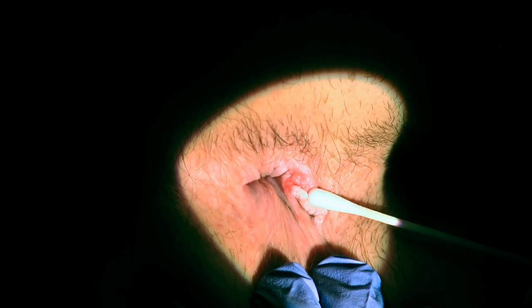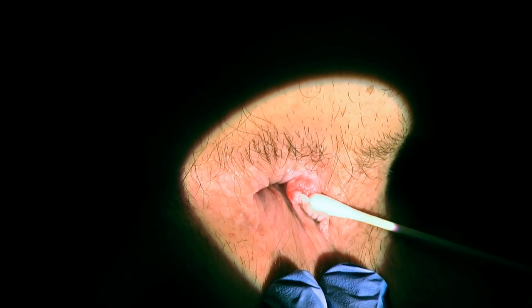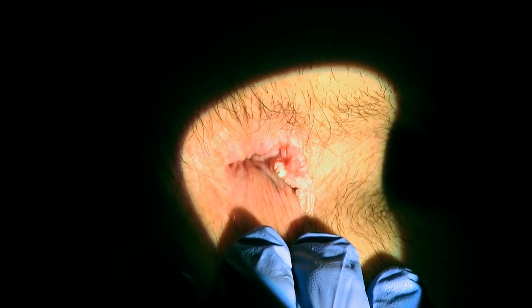That erythema may be just because of trauma — rubbing together the buttocks — but we do need to exclude any other pathology. The use of acetic acid is not really going to be particularly helpful here because we're dealing with a physically very obvious lesion. I'll zoom into the erythematous area, which is really in the right anterior quadrant, as you can see from the still here.